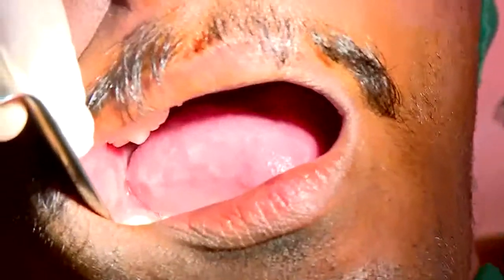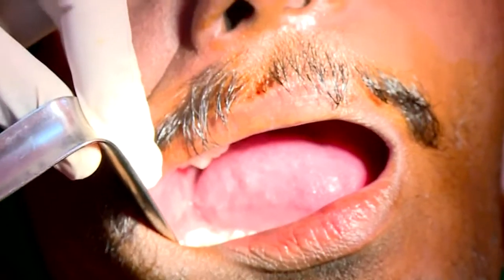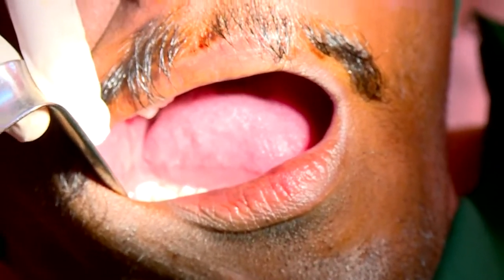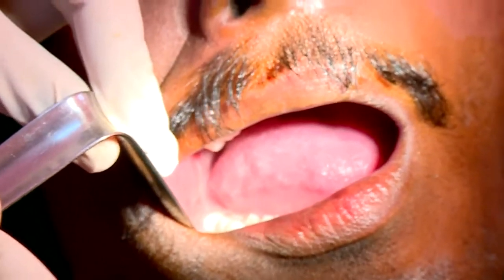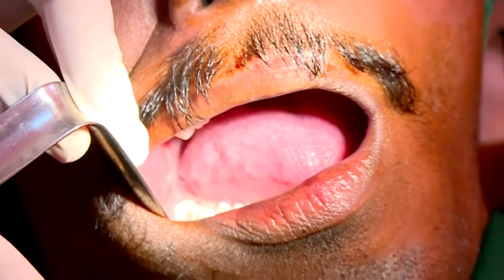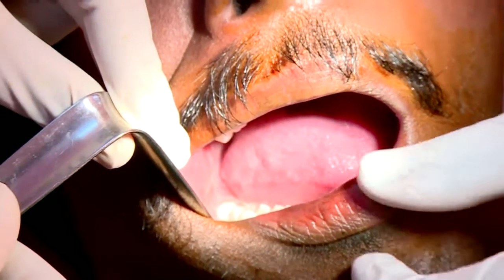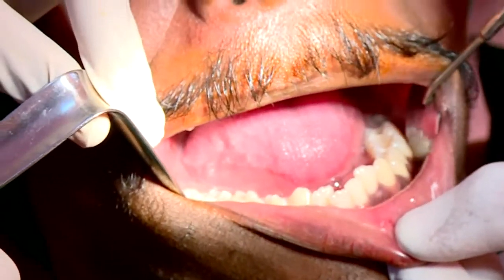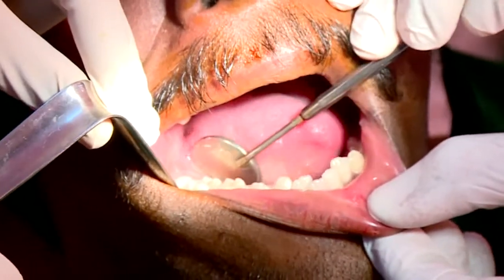So the next procedure will be after the elevation of the mucoperiosteal flap with full thickness mucoperiosteum. And the third procedure will be bone guttering. That is nothing but removal of bone around the impacted tooth and creating a trough for application of instruments, for elevation and for tooth sectioning. Once the trough and bone guttering is done, the next procedure is sectioning the tooth. Depending on the impaction difficulty, we section the tooth to minimize the amount of bone removal for the procedure.